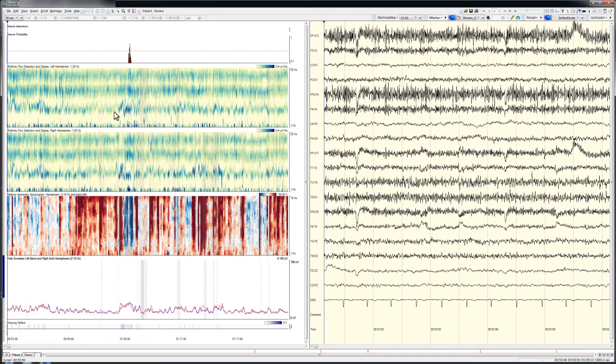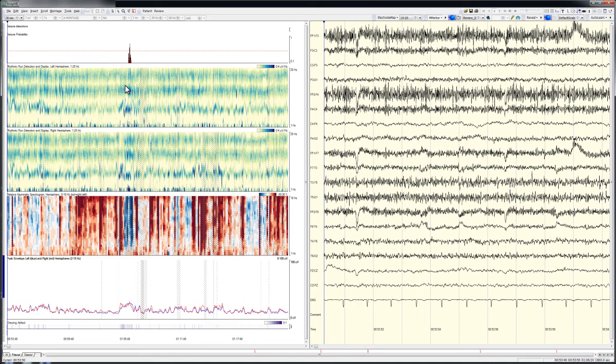Next, I turn to review of the trending graphs. Because I'm searching for patterns suggestive of seizures, I'm using a 30-minute trend view. This allows me to see even brief patterns suggestive of seizure activity. Although a longer trend view could be used for this process, using too long a window can result in loss of seizure recognition sensitivity and an increase in the number of false positives requiring evaluation. Using a 30-minute trend window, I'm able to scan through a day's worth of trends in several minutes. When I note a pattern of possible significance, I click on that spot in the trend window and can immediately assess the associated EEG.